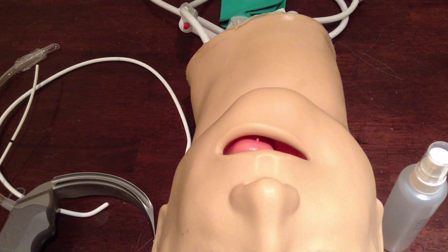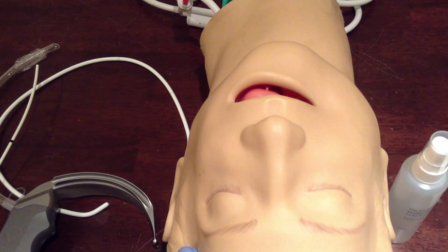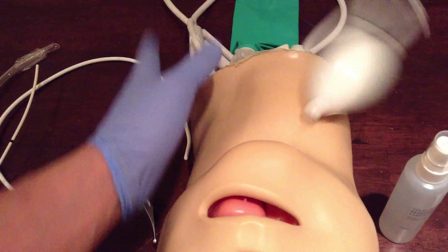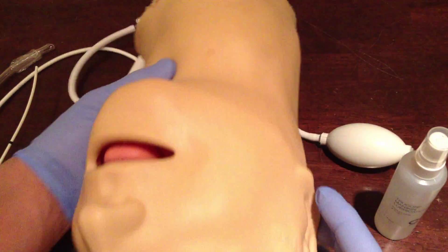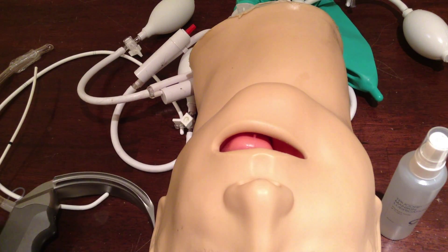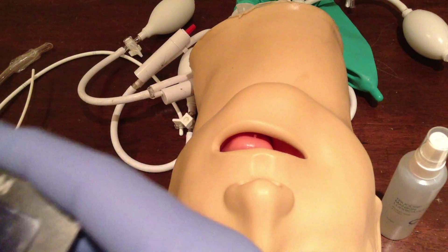This is Yen here and we're going to do a little bit of play with the airway. This is a mannequin that I got from my good friend Jim Ducanto. It's got these bags in it which you can blow up in various parts, stuck into the Liradol mannequin, and I've fully inflated them just to make a bit more of a challenging airway. We're going to practice playing with some hyper-angulated tube deliveries using my C-Mac.